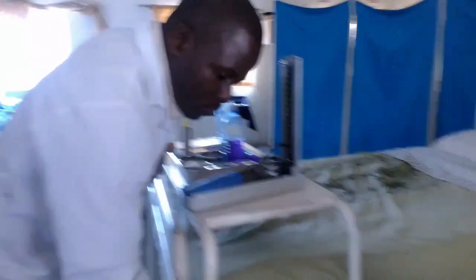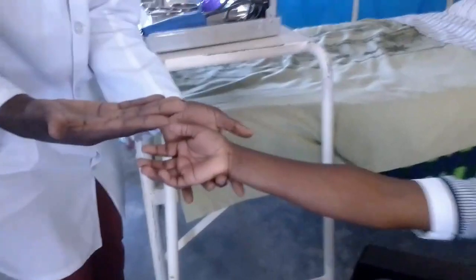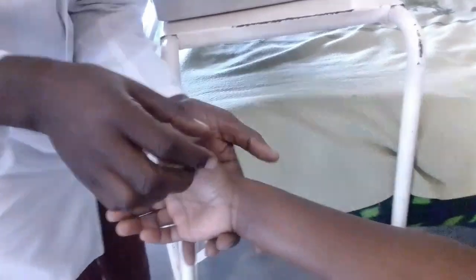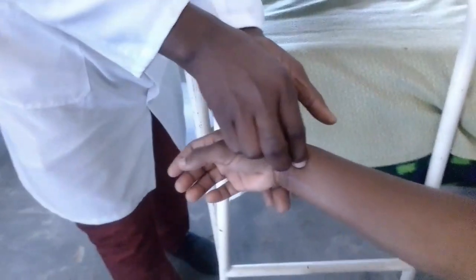Okay. So it's there. While the temperature is being taken, you need to do other things as well, like taking the pulse rate or the respiratory rate. So at this moment, I have to go and take the pulse rate. For the pulse rate, you locate the radius. Where the thumb is, this is where the radius passes, the bone called the radius. Where you see this bone prominence here, that's where you put your fingers like that. Then you test.